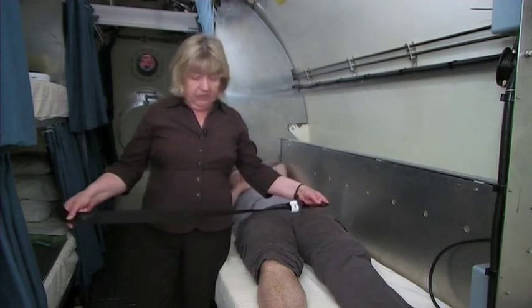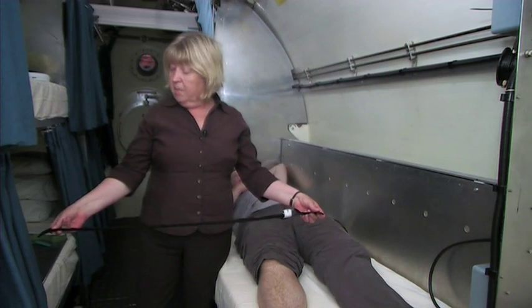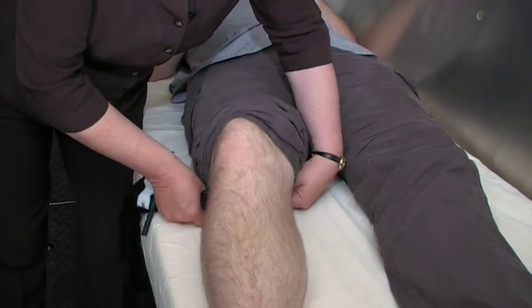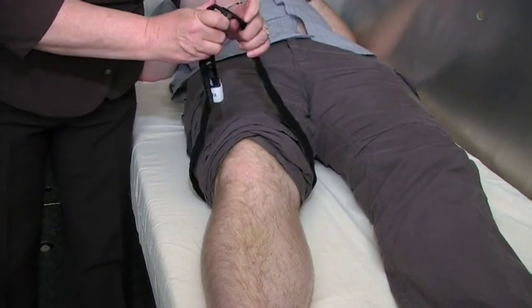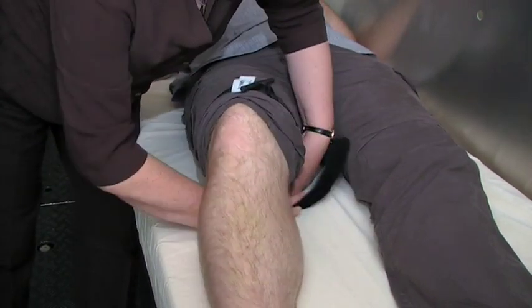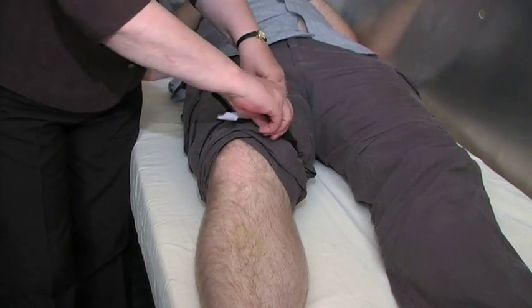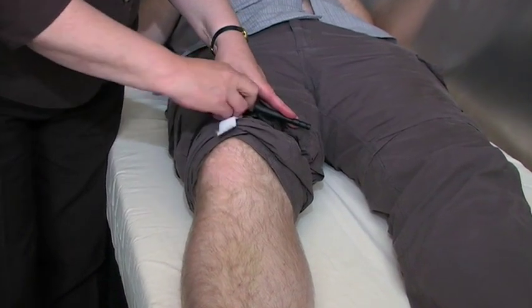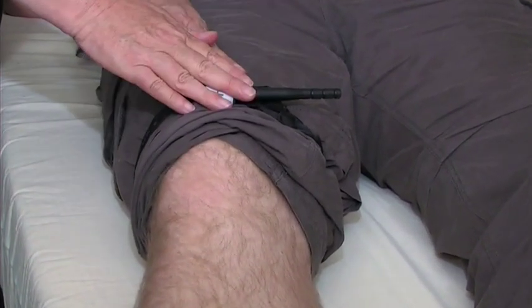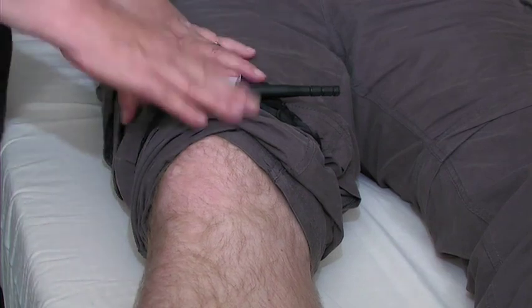What we use in order to do this is a tourniquet. This is one example of tourniquets that we use. This one is called the combat application tourniquet. So we apply this as close to the site of bleeding as possible. Remember, everything below the tourniquet will be lost because we are going to cut the blood supply off completely. Fasten the tourniquet, it then has Velcro to keep it together. And then twist the windlass until the bleeding stops. At that stage, you pop it under there just to hold it in place. There's a spot here to mark the time that you put the tourniquet on. And it's also normal to put a T on the forehead so that it's clear to everybody that there is a tourniquet on the patient.